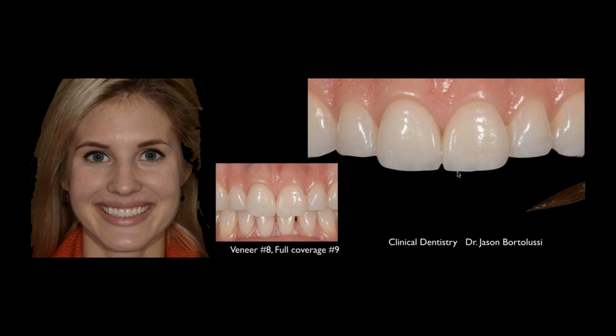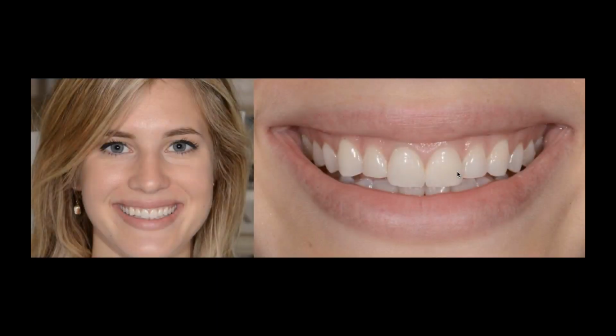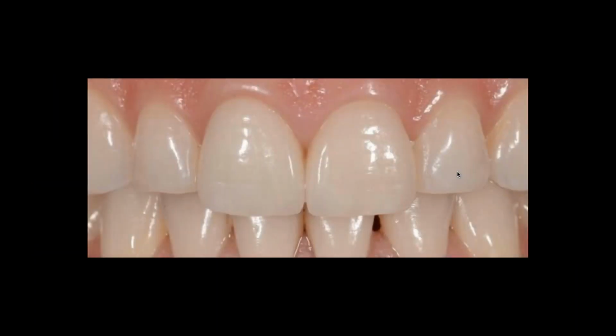More difficult, the more you mix the materials, but if you work in the same family, meaning zirconia layering with the same layering material for the veneer and manage the space the same, it becomes a lot more easy for us. So with that said, I'm pretty sure I'm just about on time here.